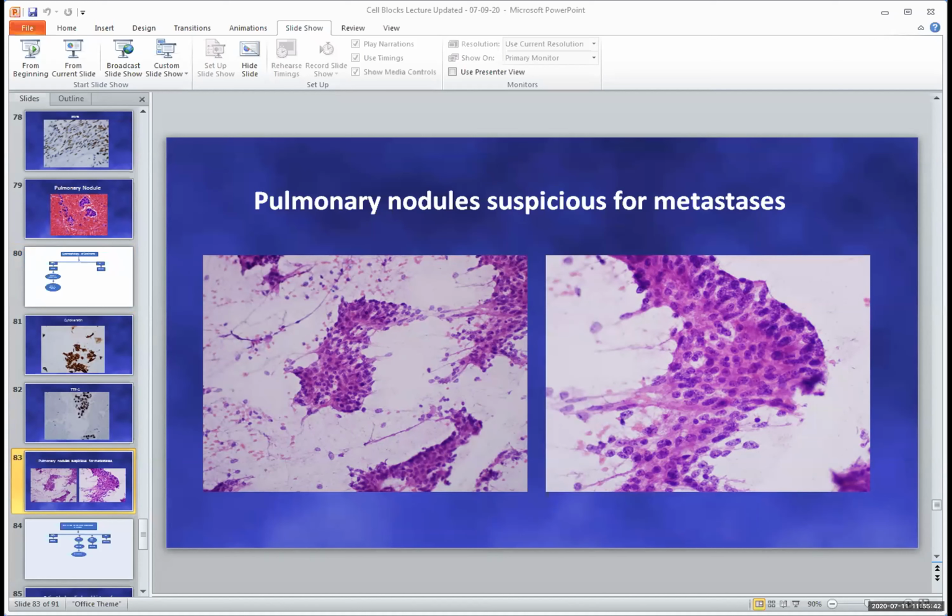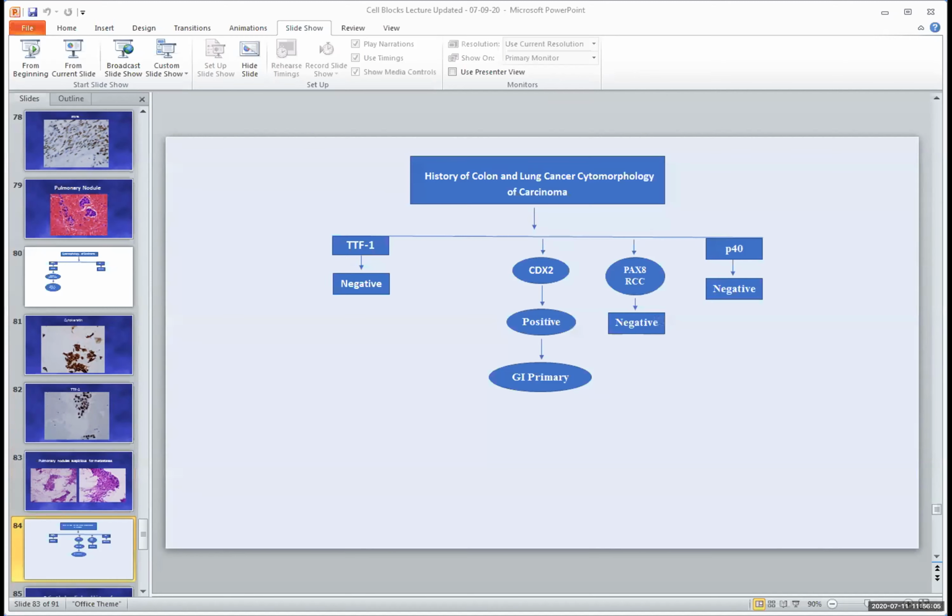And then there was a patient with multiple pulmonary nodules. The radiologist said that they thought that it could well be a metastasis or multiple metastases, although at the time the clinicians did not know of any prior history, and therefore the history we were given was that there was no prior neoplastic disease present. So it came to us somewhat of an unknown, although just as we were working up, they said, well, there might have been a history of colon cancer.